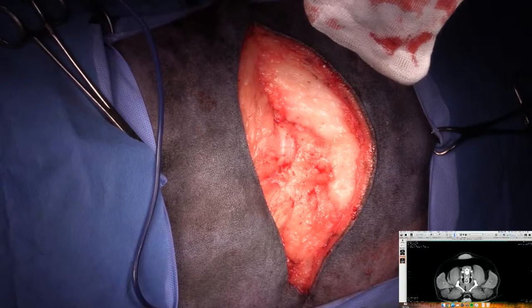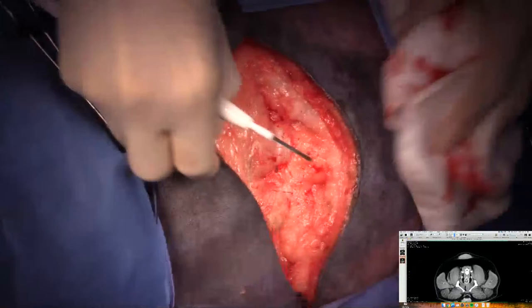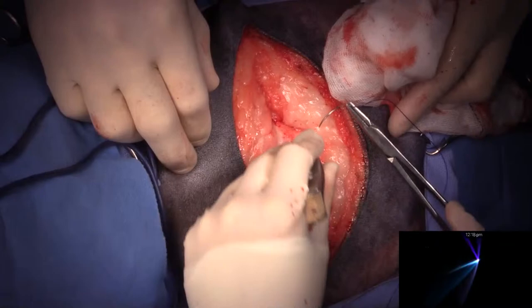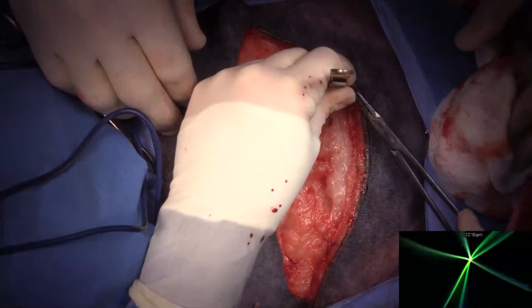There's a question, why don't we measure the margins? It comes from experience, knowing what 2 centimeters looks like. And 2 centimeters or 3 centimeters or whatever is kind of an empirical guess anyway. Again, just through experience. If I didn't have the experience, I would recommend actually measuring it with a ruler. But remember that when you take a margin that's 2 or 3 centimeters or whatever, it is just a guess as to how far the tumor cells exist from the visible tumor.